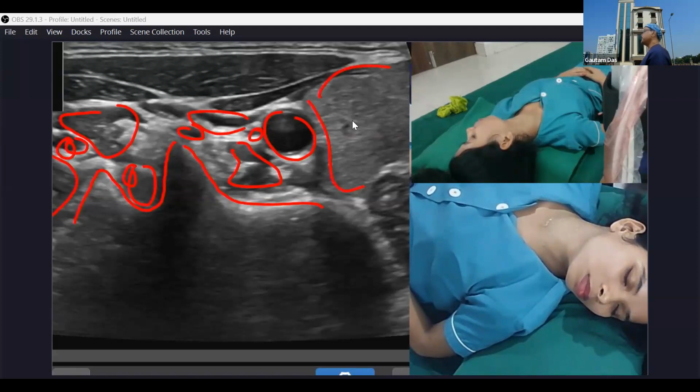Okay, I forgot to describe a few of the strap muscles there. I'll be describing that. Before that, let me talk about the stellate ganglion block. So stellate ganglion block, classically, we used to inject like this. Needle can come from here, just medial to the Chassaignac tubercle. When you used to do it blindly, we inject here.